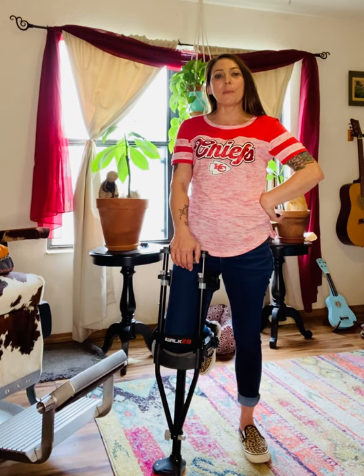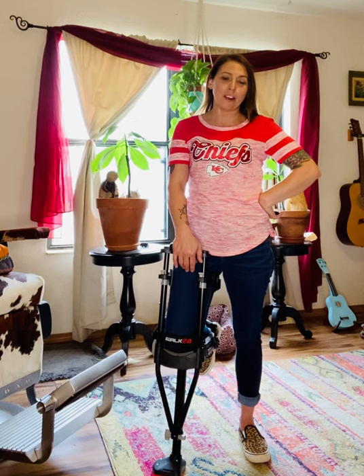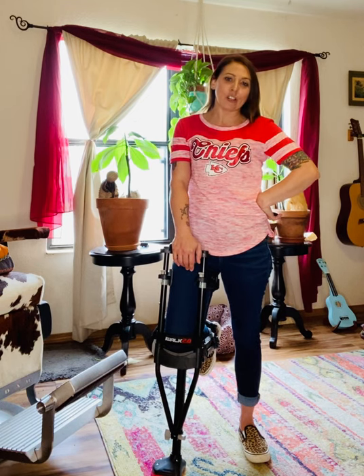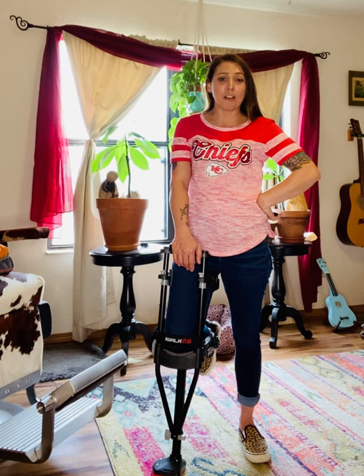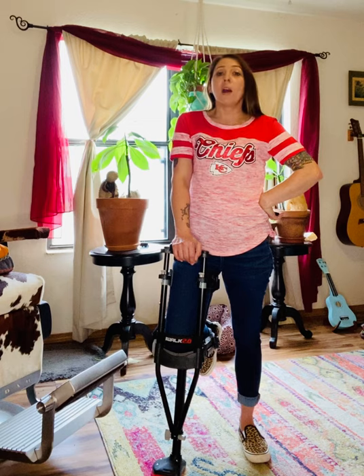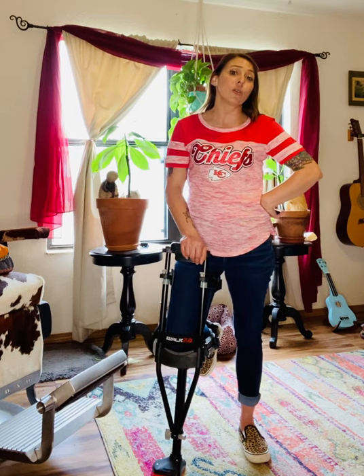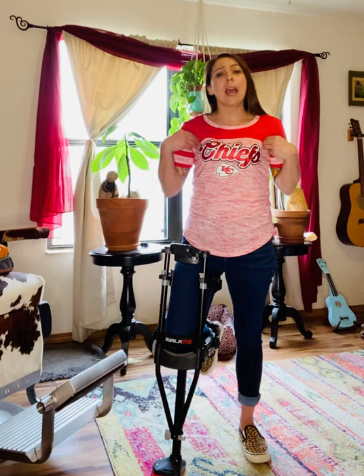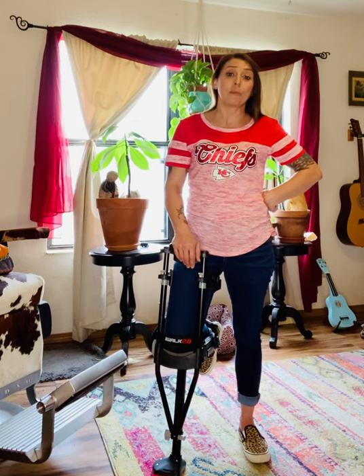Often times when somebody has a leg or a foot injury and they're non-weight bearing, we look towards knee scooters to help with mobility. But there are occasions where a knee scooter might not be appropriate — maybe there's a step to get in and out of their home. Sometimes you just have to walk, and crutches are challenging and painful and nobody wants to use them long term.